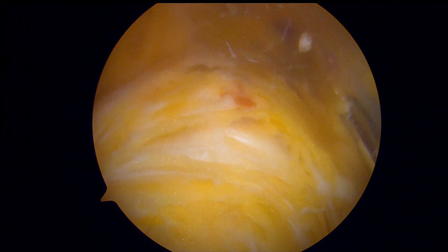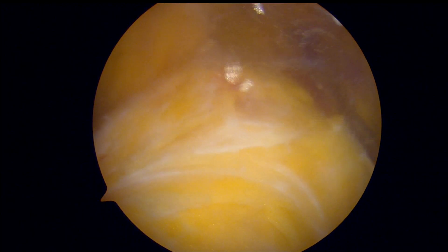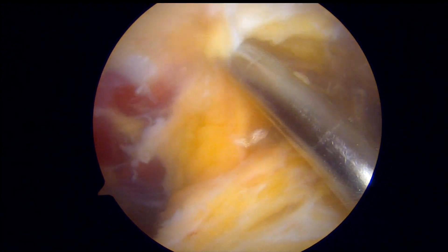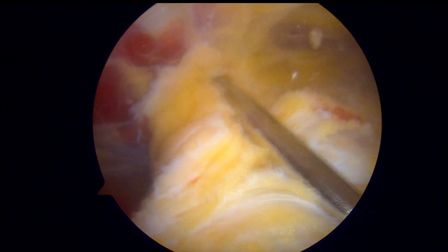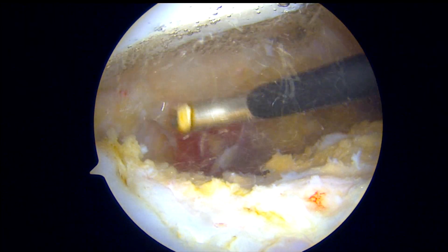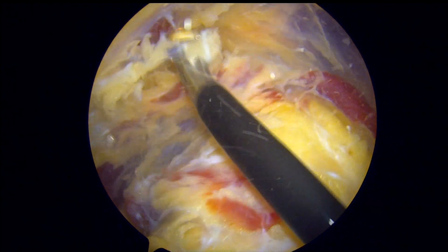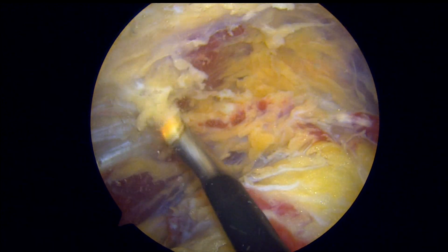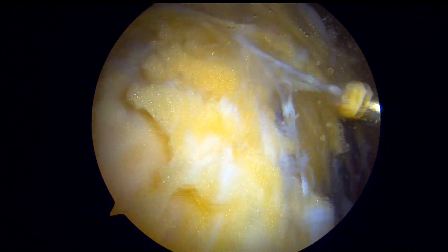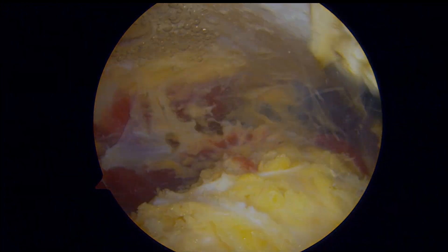The last compartment of the knee is the suprapatellar pouch. We perform an aggressive synovectomy of this region, which is the area above the patella or kneecap. There is abundant synovial tissue requiring resection, and this area has a significant number of bleeding vessels once the synovium is resected. The ArthroCare wand is meticulously used to assist with coagulation of any bleeding vessels. Once this is complete, this completes the entire synovectomy of the knee.